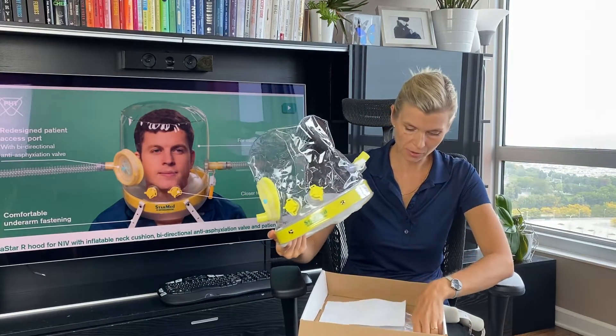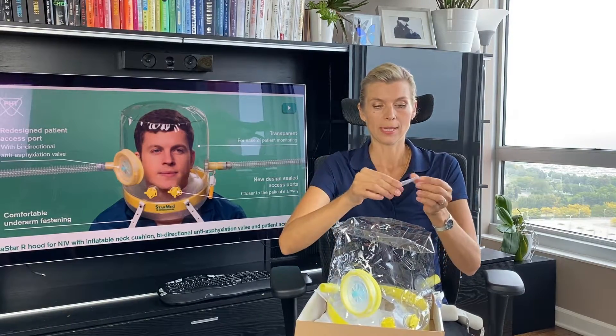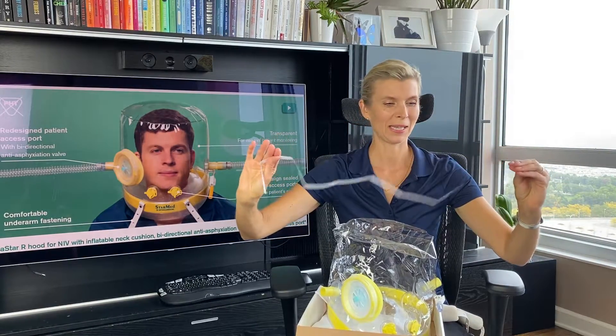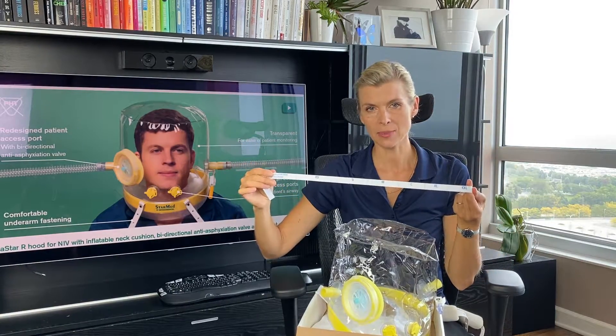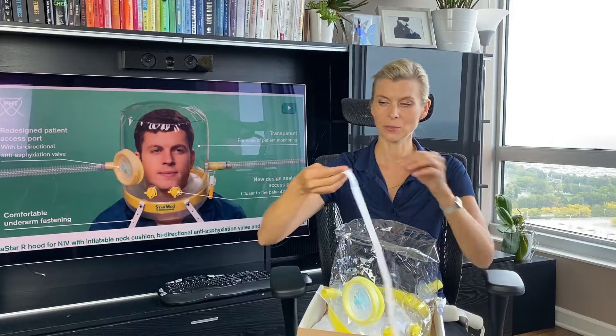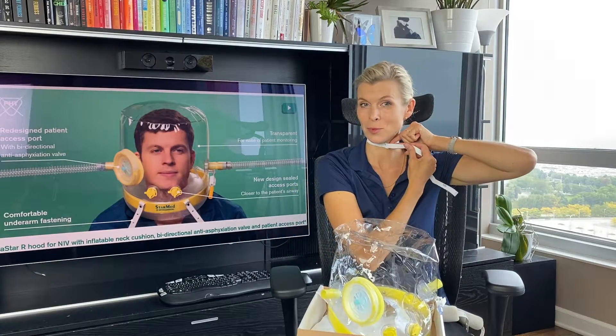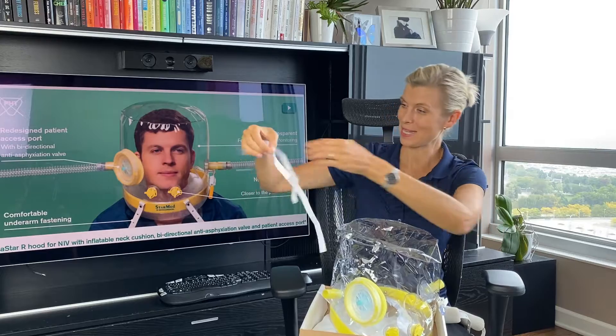I will show you how to put this on a patient. First, you want to make sure you choose the correct size. It's a very simple measuring tape, and as you can see, the helmet comes in six sizes. When you measure the patient's neck, it will tell you what size to use. I'm guessing I'll need a small — this helmet is large, so I have a model here who will use it for our later demonstration.